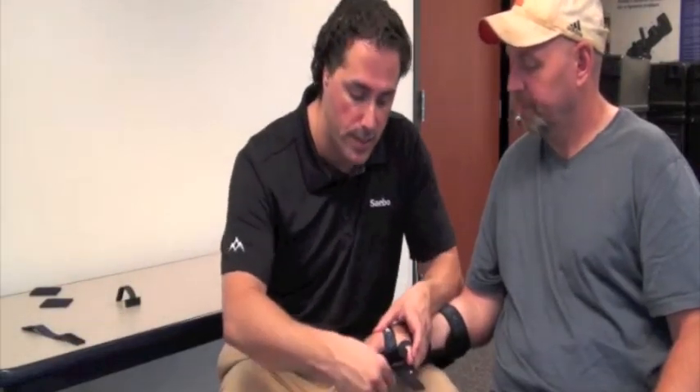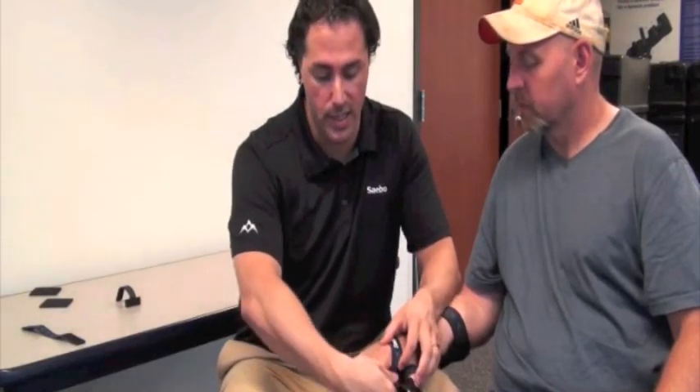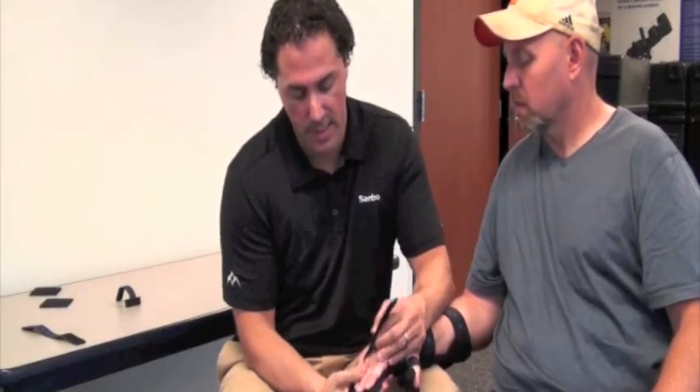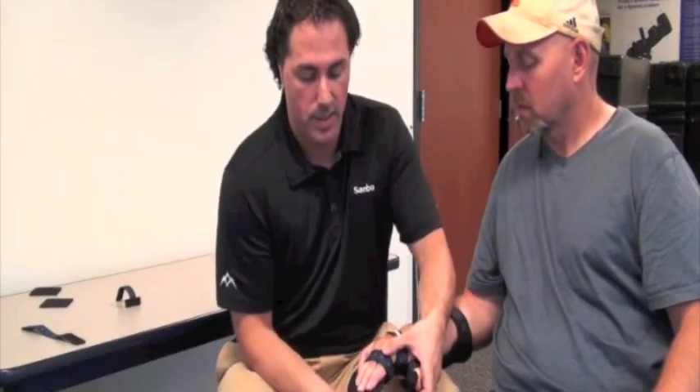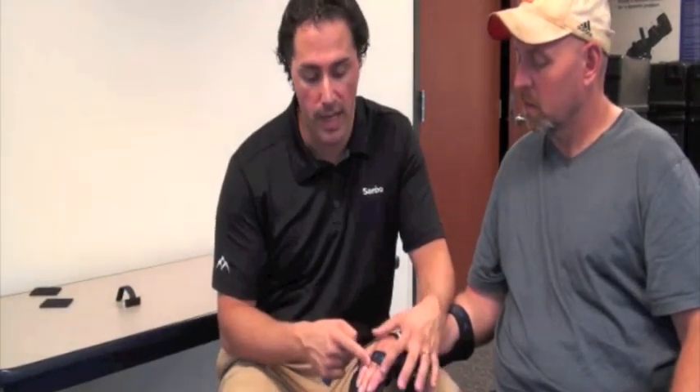For the purpose of this demonstration, I will do both straps. Attach the finger strap to the volar side of the Sabo Stretch and come around — have it nicely attached, pull it around, and it will hook to the Velcro. For the second strap, make sure you don't cover the PIP joints. You want a strap just proximal to the PIP joints, and the second strap just distal to the PIP joint.